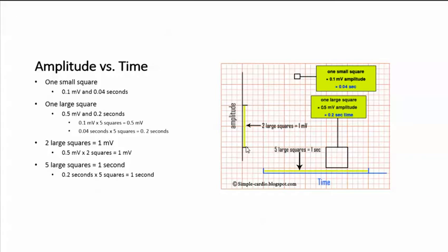Two large squares equals 1 millivolt. We get that by multiplying 0.5 millivolts times 2 squares. That's 1 millivolt.